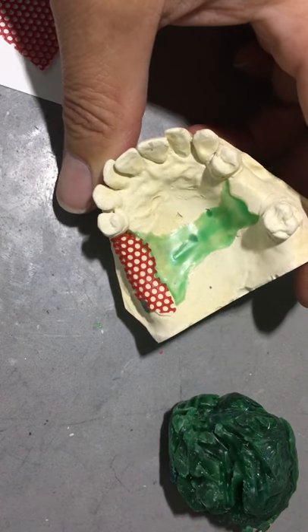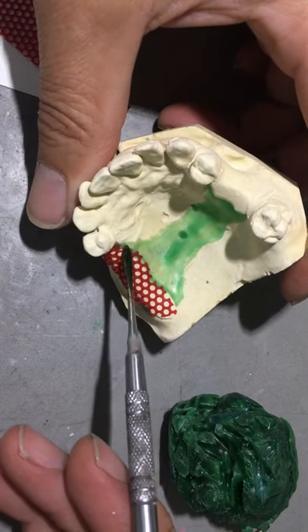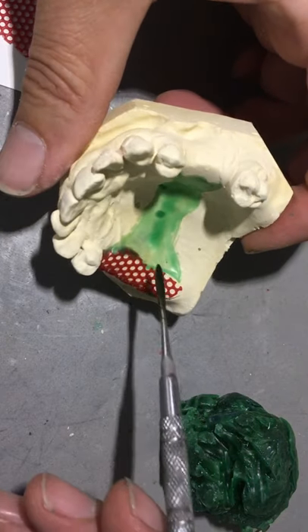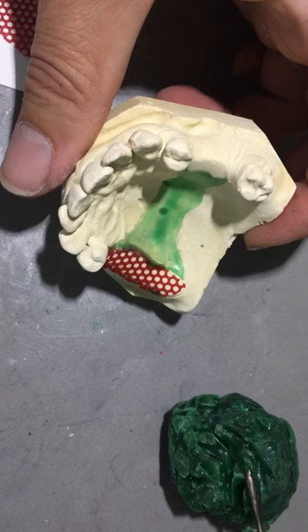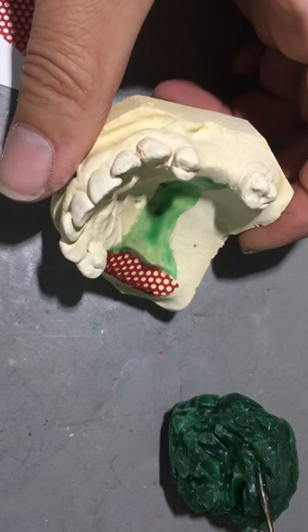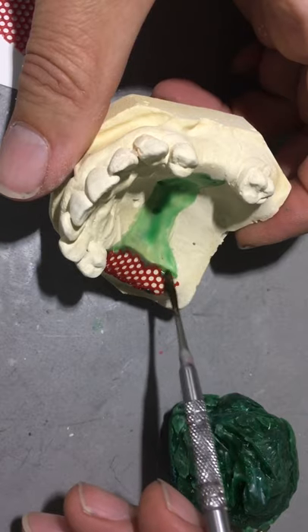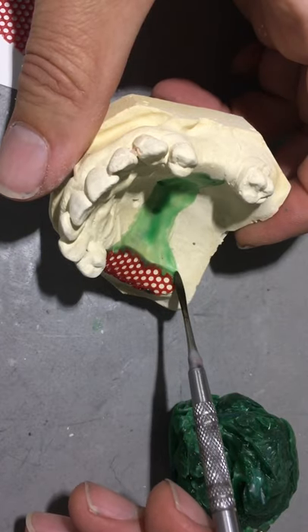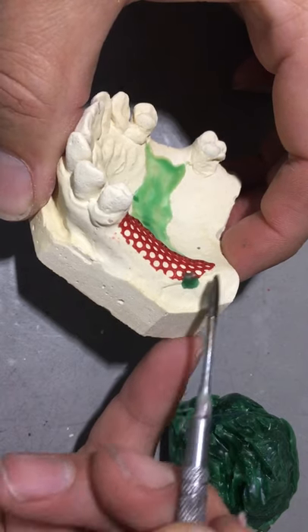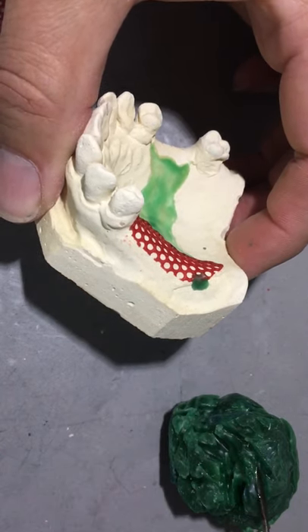The next step is once I have the retention in place, I'm going to fill roughly half a row or a full row to the major connector. This is my internal finishing line. On the outside or the extension beyond the block out, I have my tissue stop.